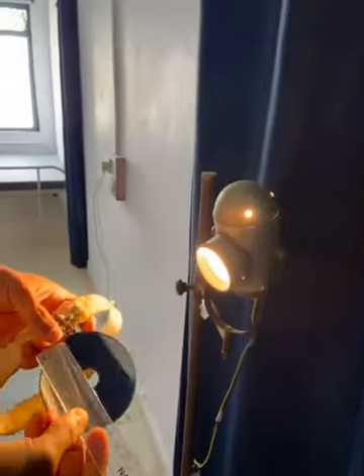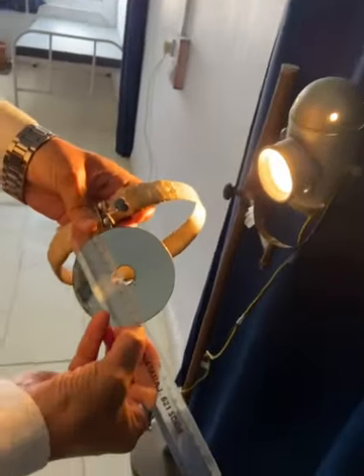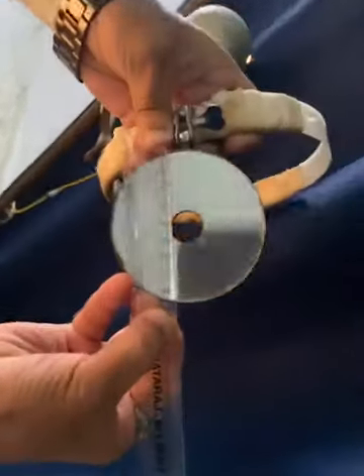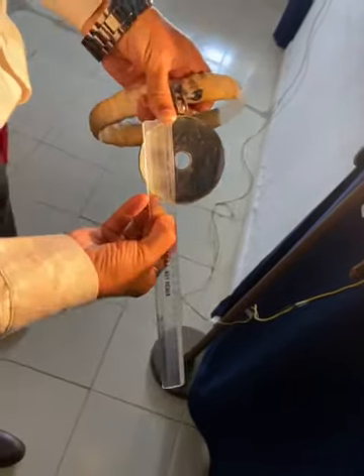Diameter of the mirror is 9 centimeters. We are demonstrating the diameter of the mirror here — 9 centimeters, as you could see here.